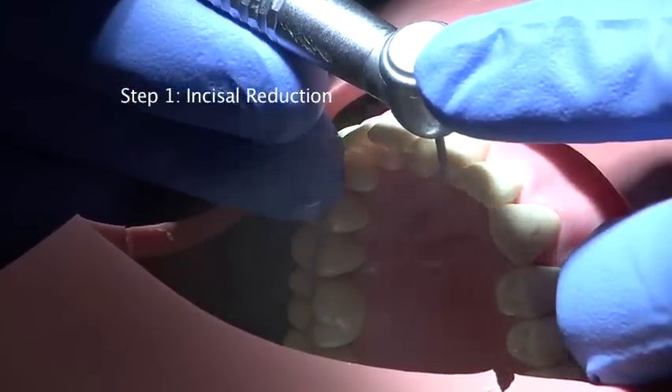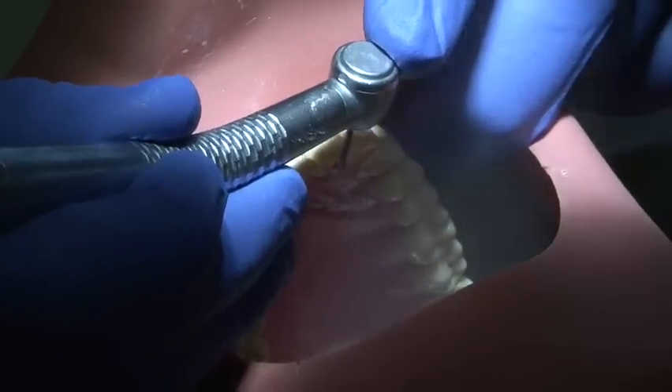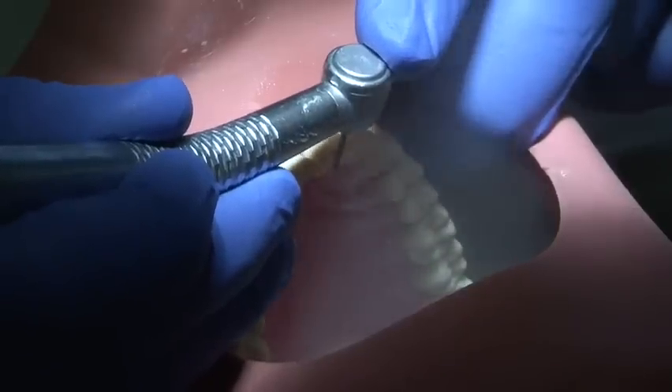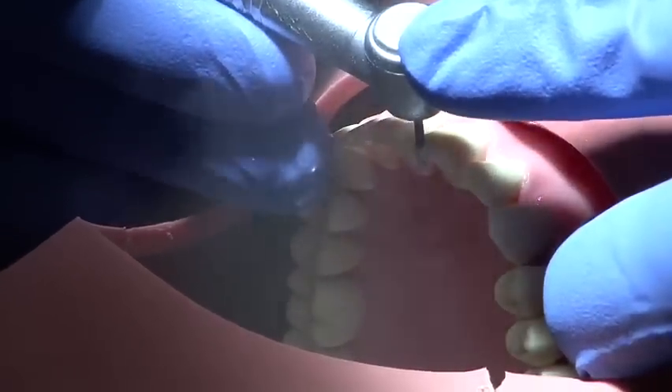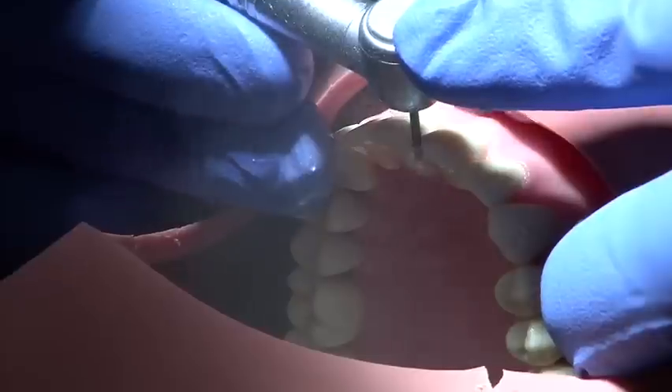Incisal reduction is carried out to a depth of 2mm using a parallel sided medium grit burr. Depth cuts can be employed first of all using a smooth continuous action to prevent overheating of the tooth, and these are then joined together to perform an even reduction.